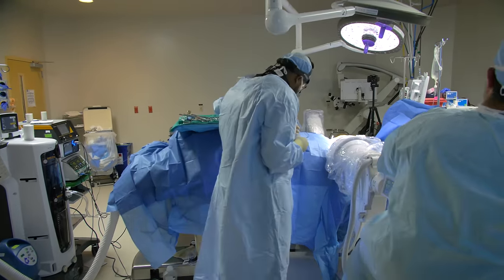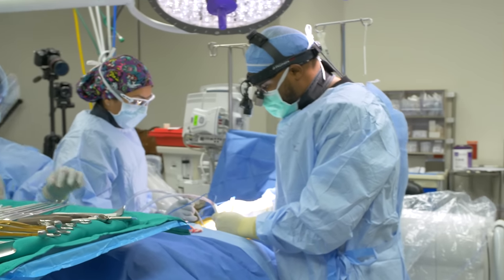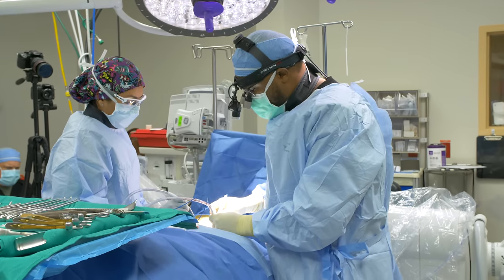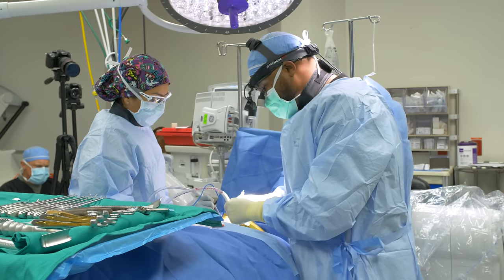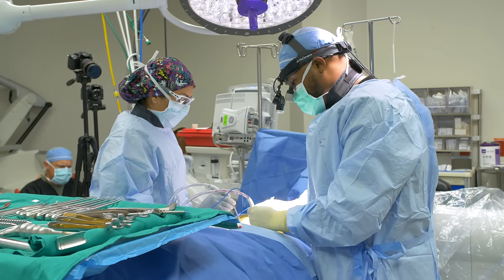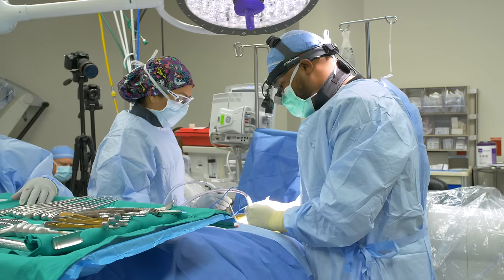Right now I'm just getting my exposure at all the levels. I'm up at C4-C5 now, just cleaning off the soft tissue. She's holding the esophagus and the trachea to one side, and I have the carotid artery and the sternocleidomastoid muscle to my side over here. There are huge bone spurs in here.